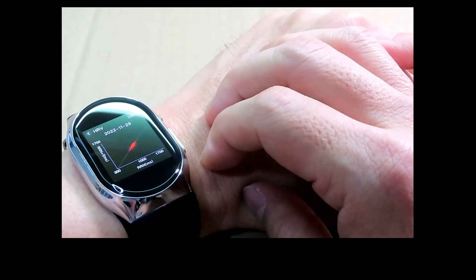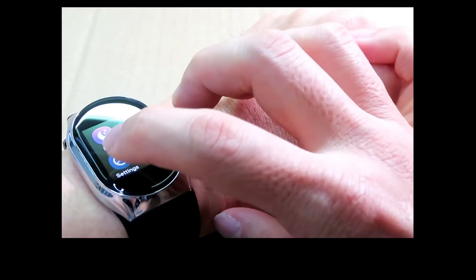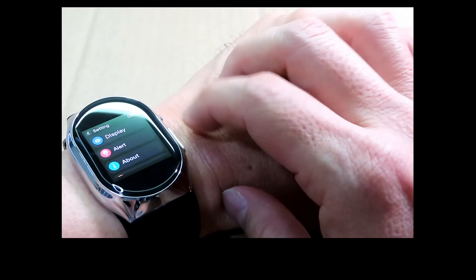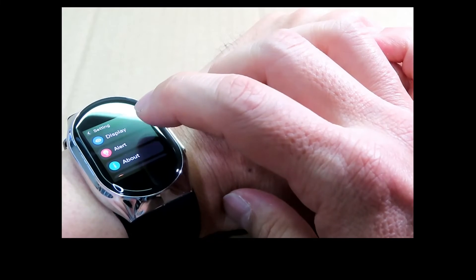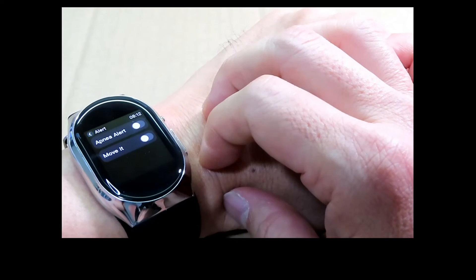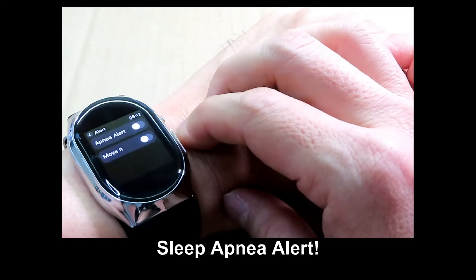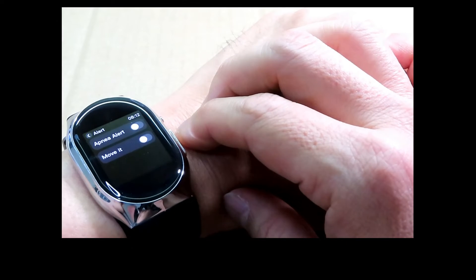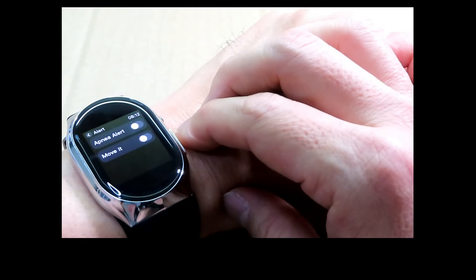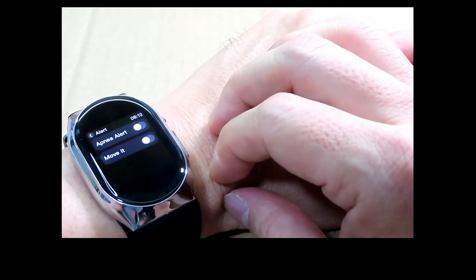Under settings you can configure the display. There are alerts — notably a sleep apnea alert, and if you are stationary for some time, you can turn on the move alert to remind you to start moving.